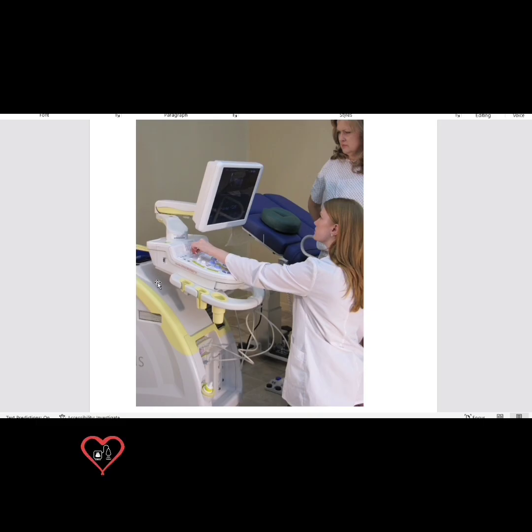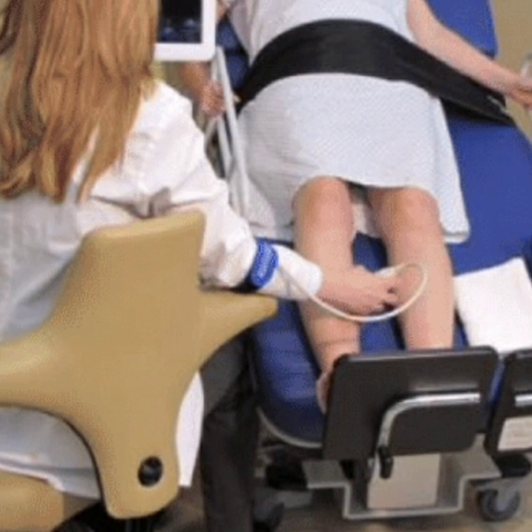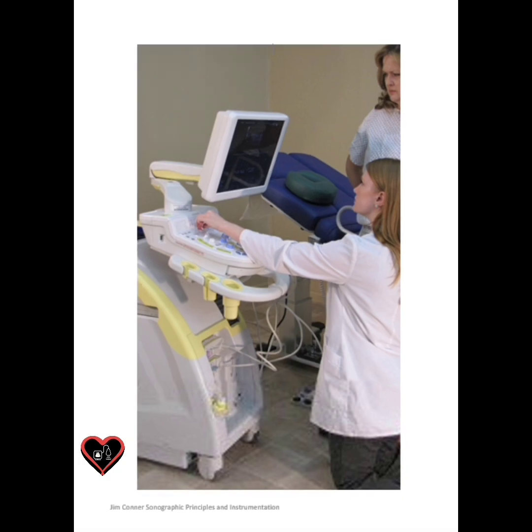Tell me what you can do to fix this image. It looks like the sonographer is performing a venous insufficiency exam, which sometimes requires scanning while on their knees. However, to correct this image, the sonographer should place the patient in the gurney or bed in reverse Trendelenburg. You should never scan on your knees. She needs to lower the machine closer to the ground. The control panel should be lowered and the monitor should be at eye level without looking up. The best correction is to scan in the neutral position and move the machine closer so she doesn't have to reach as far.